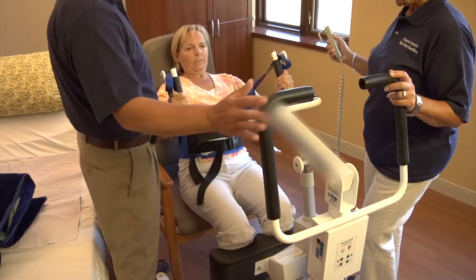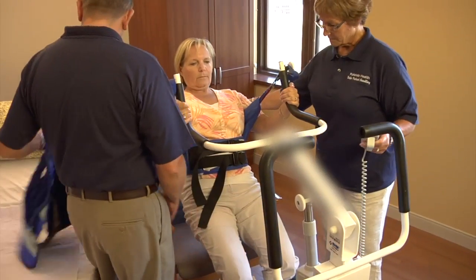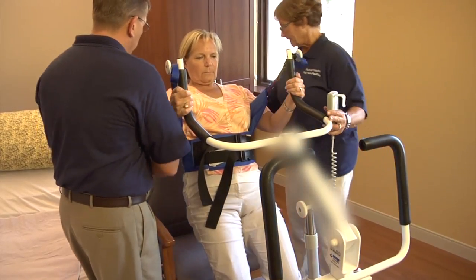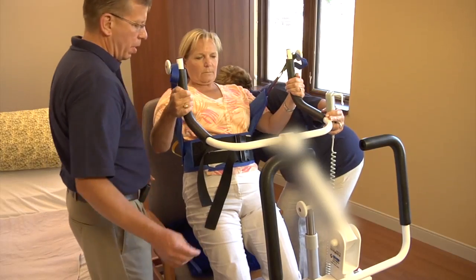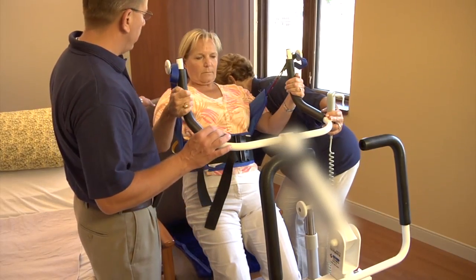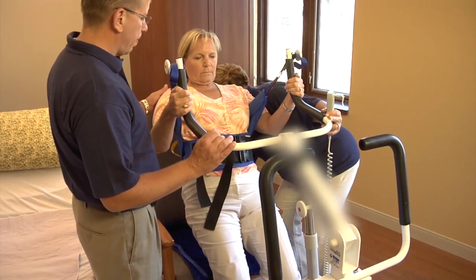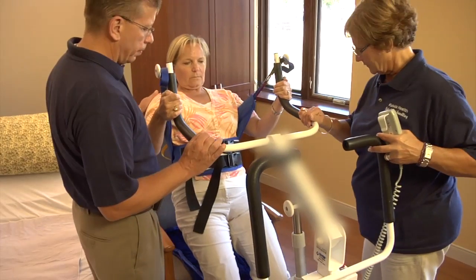So what we're doing in this clip is we're just lifting this patient high enough to put the device under them, and then we're going to put them back in their chair. This is a perfect example of repositioning a patient without manual exertion. The use of equipment quickly and easily safely puts that patient back into the chair and into a good position.